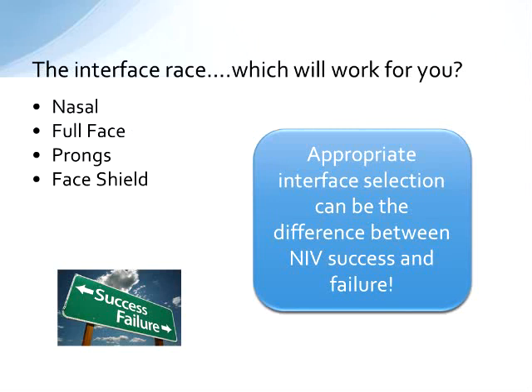So you have some options, some of the same options that you have in the adult patients: nasal mask, full face masks, also known as oro-nasal masks, nasal prongs or pillows, and the full face shield. Now, the truth is there's very little evidence. Evidence is certainly lacking which interface would be considered, quote-unquote, the best, and that's true in the adult patients as well. But the truth is, the one that's the best is the device that your patient is going to feel the most comfortable on, and is more likely to be compliant on.